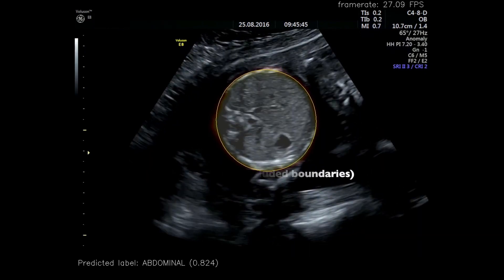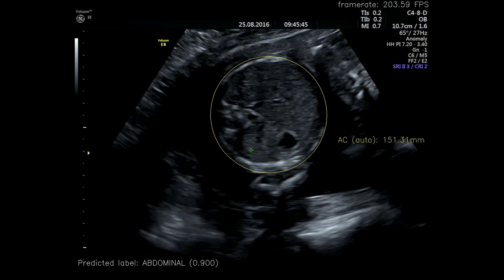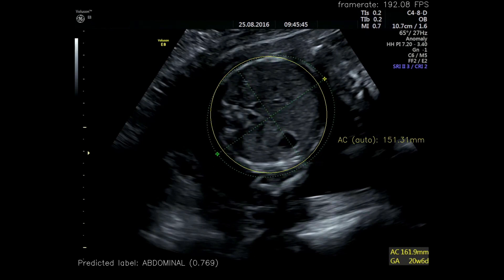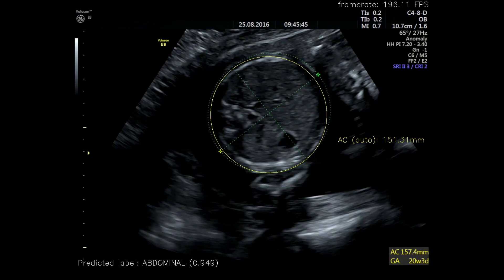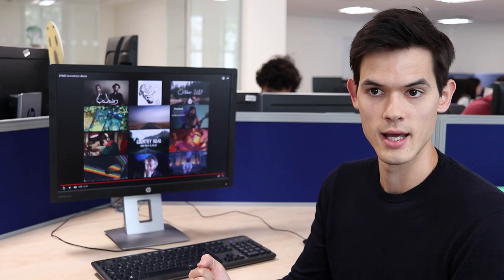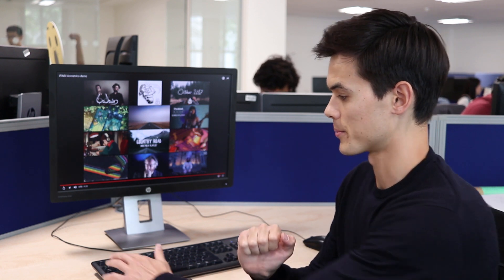The great thing about this is that it can be used in real time. Clinicians typically take a couple of minutes to find the necessary plane, and then it can take up to another 30 seconds or so to actually annotate the plane appropriately. What you can see here is that our model is able to annotate in real time as the clinician is moving the probe, allowing them to potentially stop earlier.